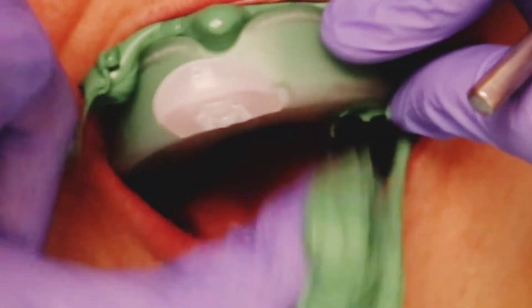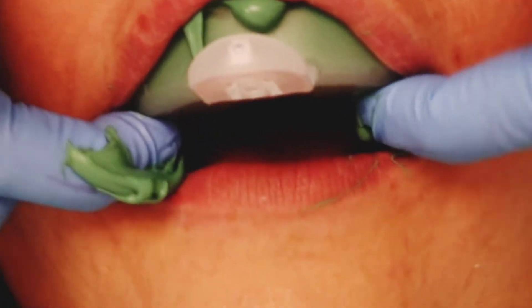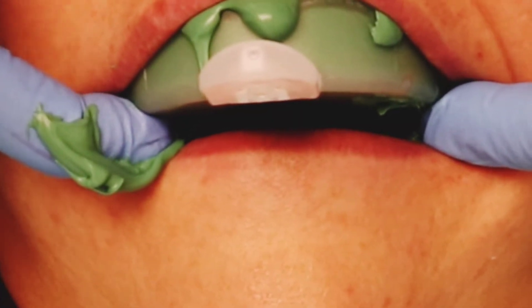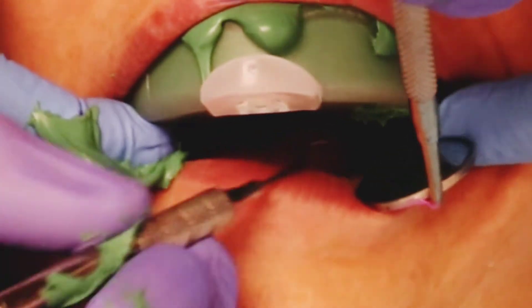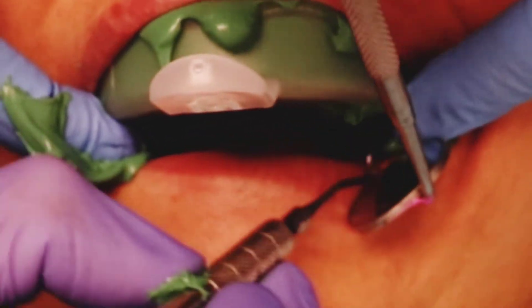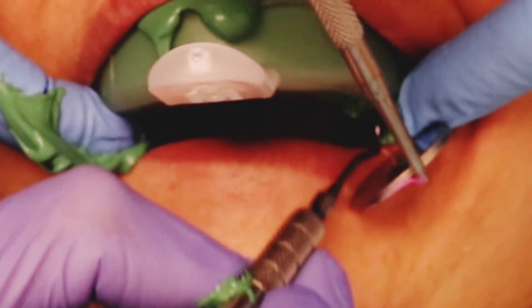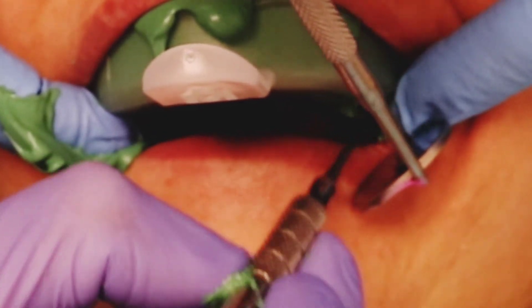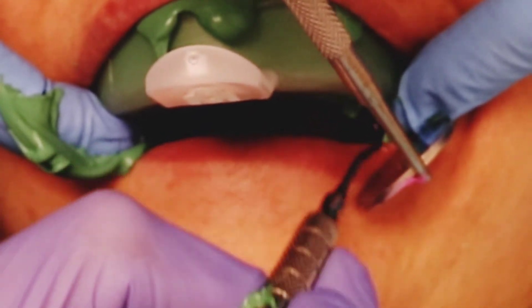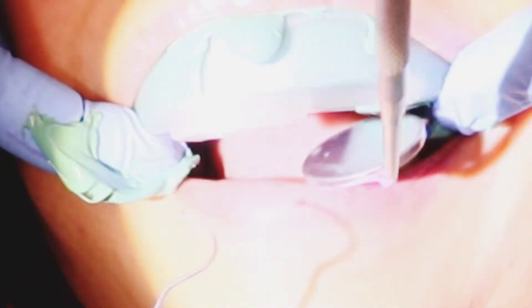You can see the heavy body material in place. You're going to get a lot of extra material coming loose over the hole you created, so it's good to have four hands — have your assistant help hold the tray. One tip I like: I use an amalgam condenser to condense the PVS material, pushing on it slightly. I don't like any tug back. I get really good impressions with this technique — it works in my hands. I don't have any remakes or problems with crowns I cement in place.